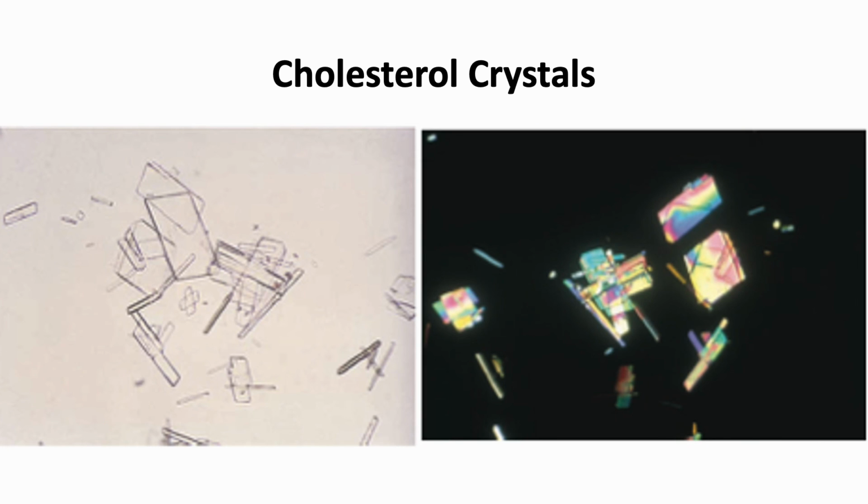Cholesterol crystals are rarely seen unless the specimens have been refrigerated. Since lipids tend to remain in droplet forms, cholesterol crystals tend to be very rare. The most characteristic appearance of cholesterol crystals is rectangular plates somewhat notched in one or more corners. They are associated with disorders producing lipiduria, such as nephrotic syndrome, and are often seen in association with fatty casts and oval fat bodies. Cholesterol crystals are highly birefringent under polarized light.